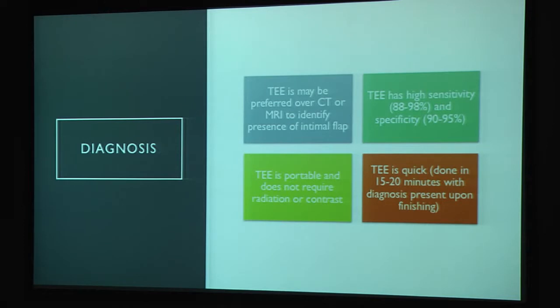You have a definitive answer once the test is done. But some of the other issues with it is most times these patients present to the emergency room. And at our institution, CT angio is going to be the way to go because it's something that can be done relatively quickly from the emergency room. We typically don't have someone standing by that can perform TEE very quickly in the emergency room when these patients come through the door.